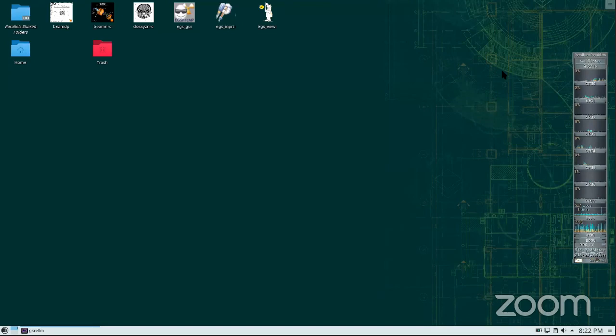Another two questions. We're going to do this when we do the beam simulation, beam NRC. You're going to hate that, because you need to tweak the beam model, and the only way to make sure your beam model is correct is by comparing whatever the simulation gives you for the PDD with the measurements, as well as the profiles and so on. Okay, what's the next question?